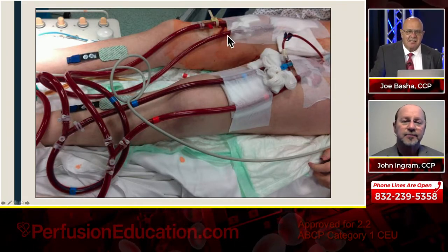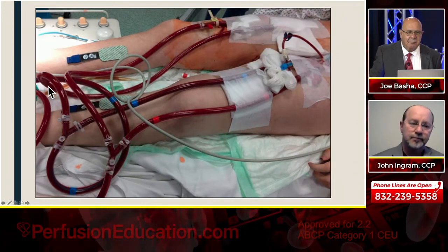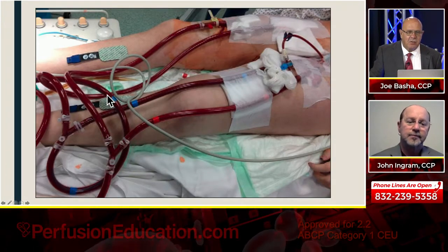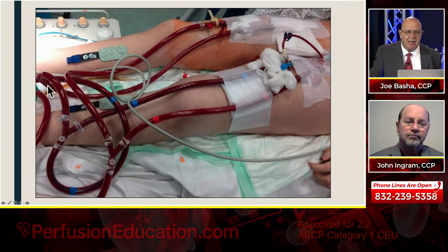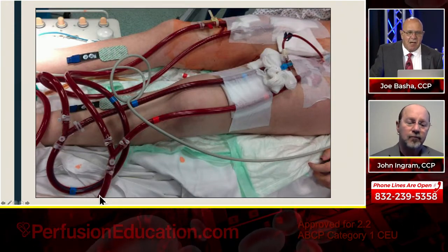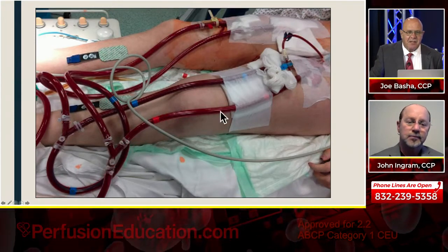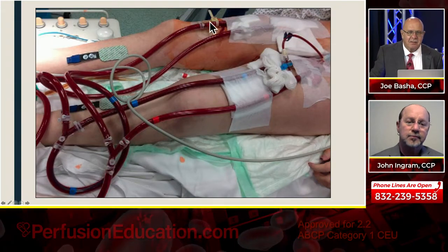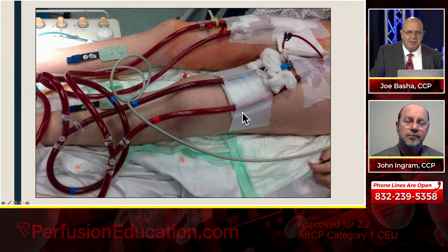So I want to go over this again. Here is an access catheter going down. There it is, making that little loop, going like this, and this is going to the inlet of the centrifugal pump of the ECMO, and then to the oxygenator. And then here you have, coming from the outlet of the oxygenator, your return going to the patient, and here going to the patient. So you have access, access, return, return.